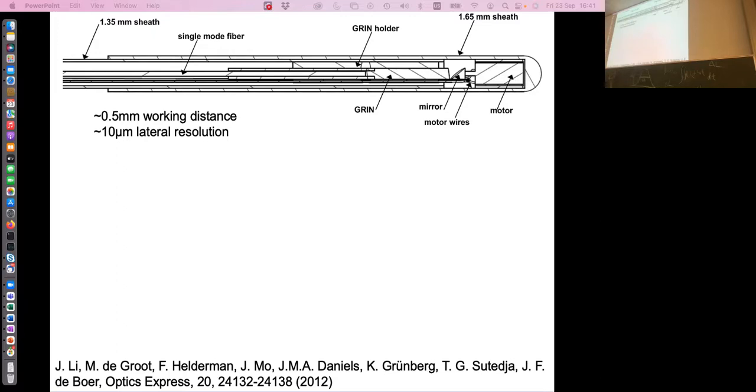So that is why endoscopy is very popular, and why OCT has been developed for cardiovascular imaging, for other reasons, but for the lung, for the esophagus, and for the bladder, OCT is being used to find tumors.